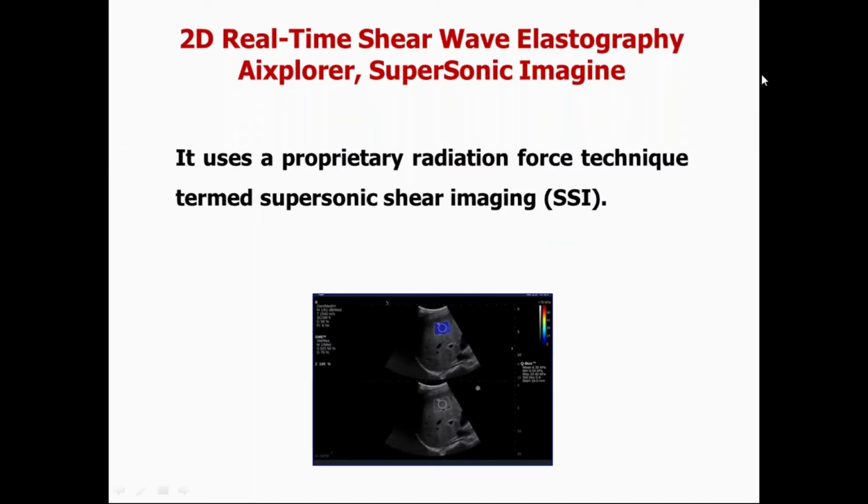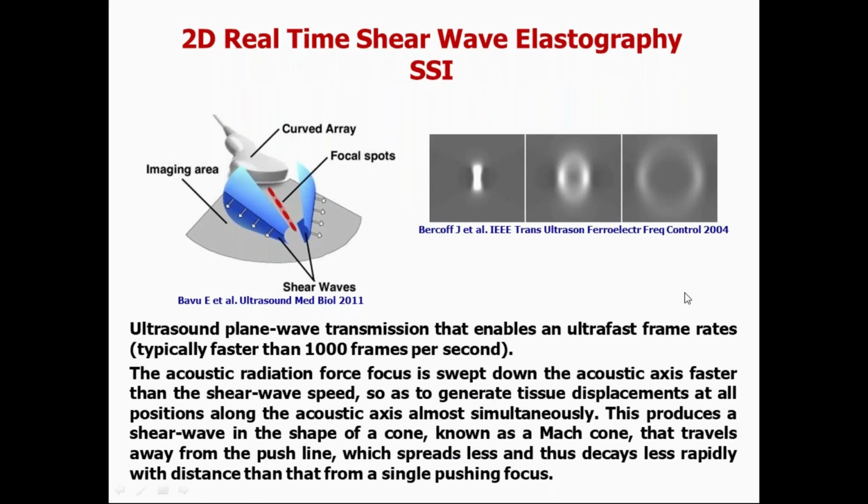SSI is different from the other methods because it's a true real-time shear wave elastography, and it uses a proprietary radiation force technique that is termed supersonic shear imaging. In supersonic shear imaging, it is possible to reach a very high frame rate, more than 1,000 frames per second.